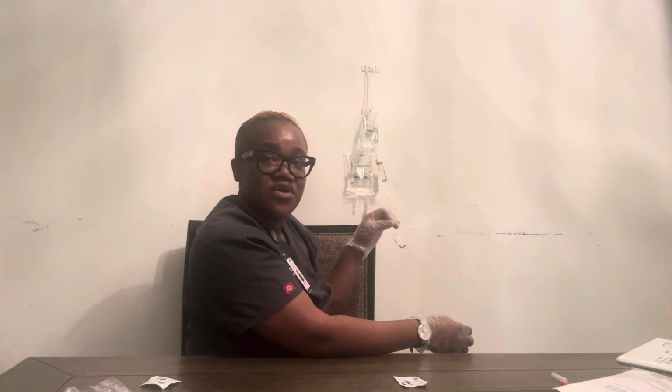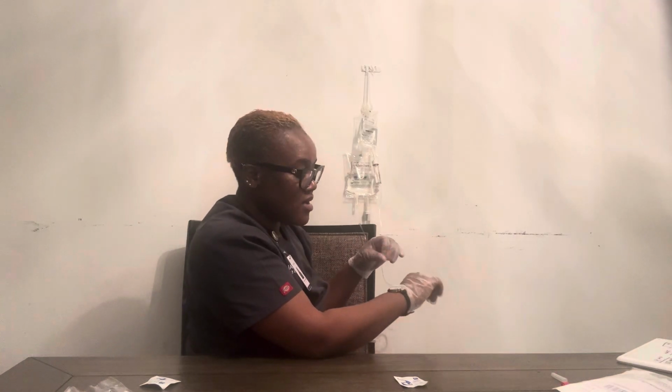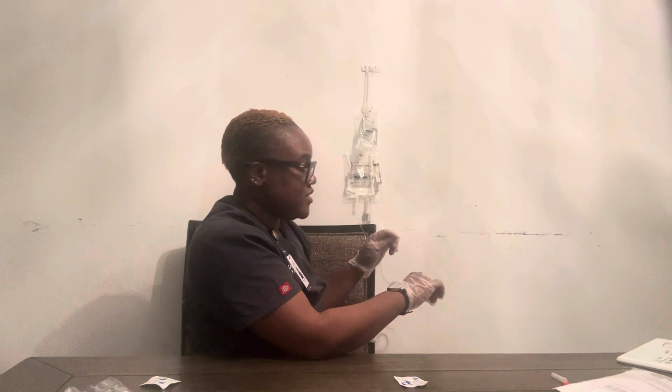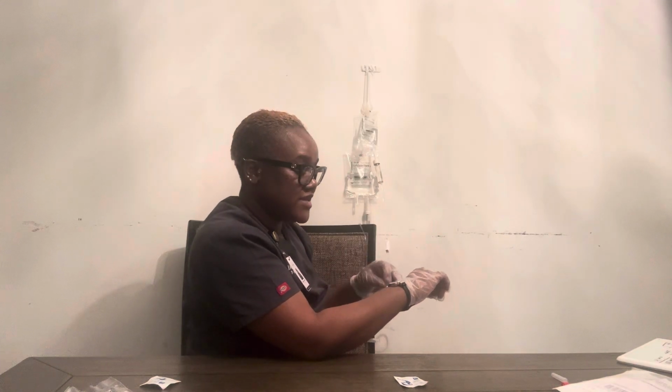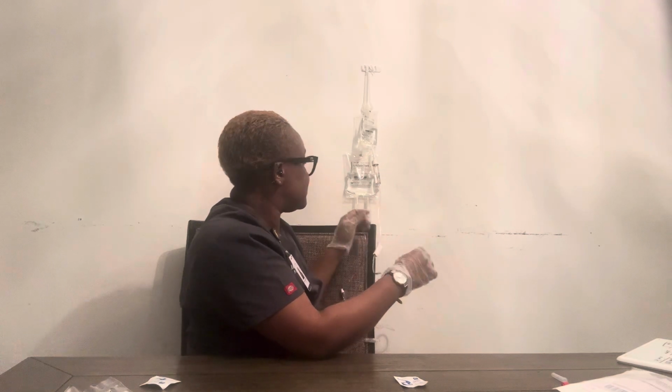I'm gonna double check my drip rate. I'm supposed to have 133 drops per minute. So now I'm gonna count for 1 full minute to ensure that my infusion rate is accurate, to ensure I have 133 drops.